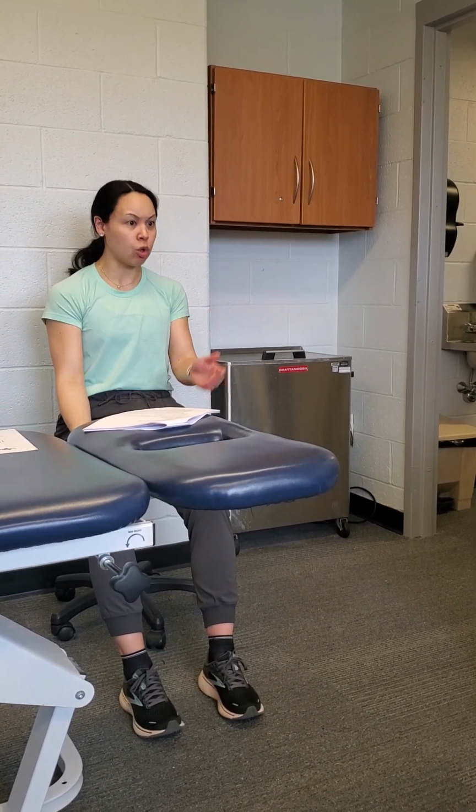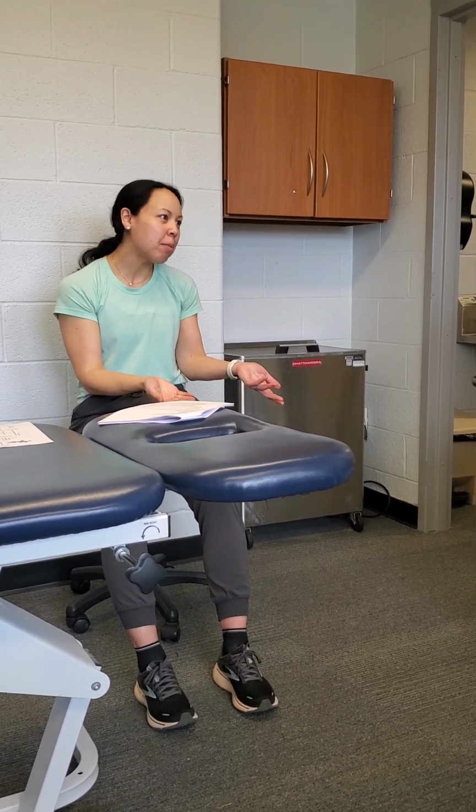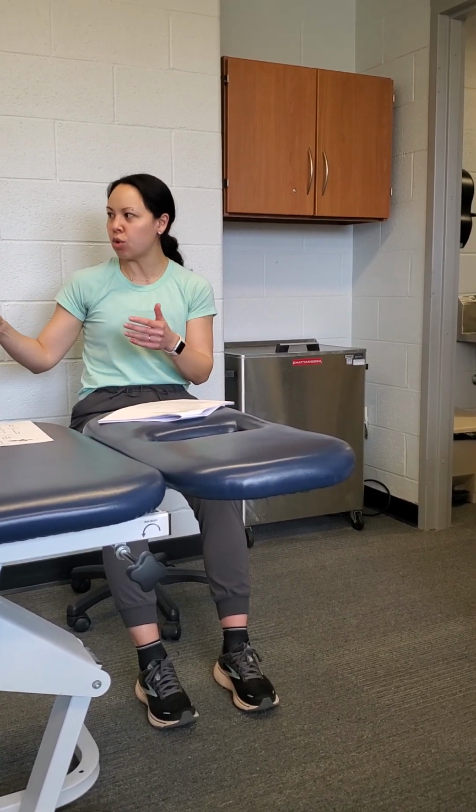Right. Go through your 30, 15, 15, 15, and then if you make it to 75, go to a 3 or 4 pound weight. And if they're struggling, say in the real-life second clinic, that's probably what we're going to do. It's going to be the quickest way. And I think the more you use it, you're going to get a sense of what people can do.